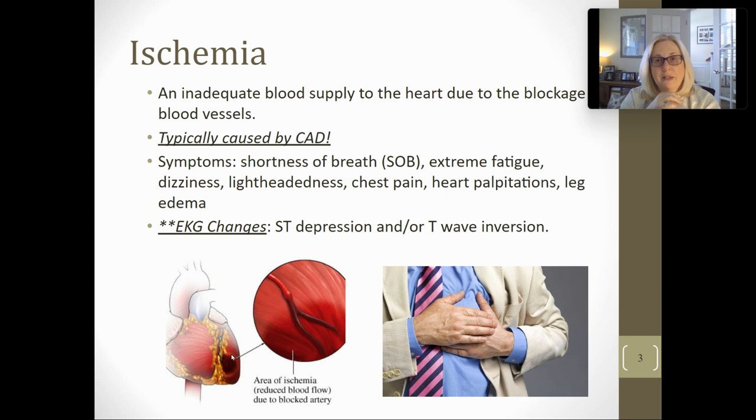T wave inversion is exactly what it sounds like. That T wave that's at the end, that's supposed to be a positive deflection, will now be a negative deflection. It'll be upside down. So the isoelectric line is here. Instead of the T wave doing this, T wave is going to do this. Okay. So, and the deeper the T wave inversion, the more blocked it is. We're going to learn that too. Okay. So ST depression and T wave inversion.